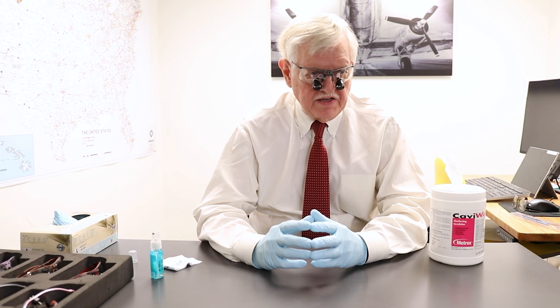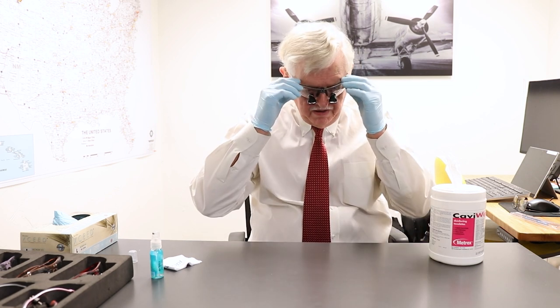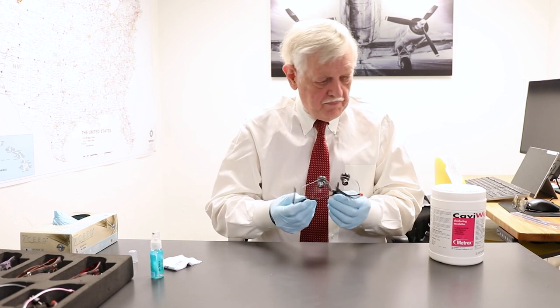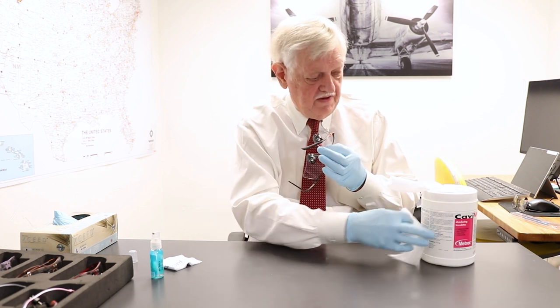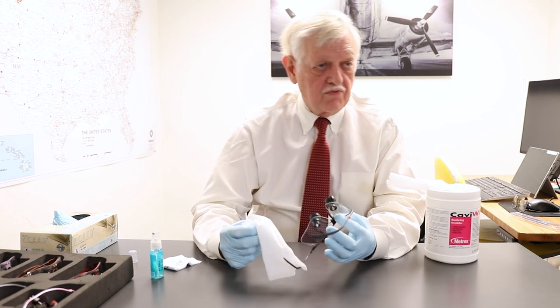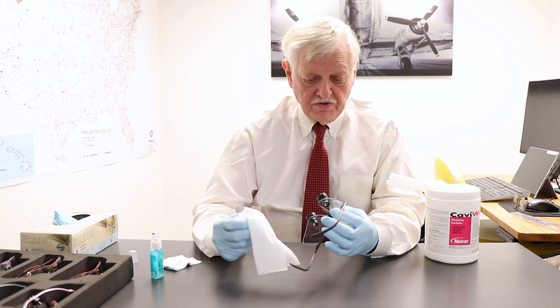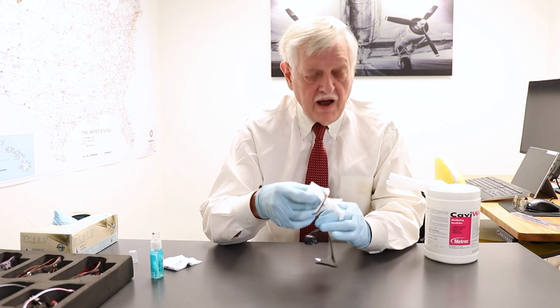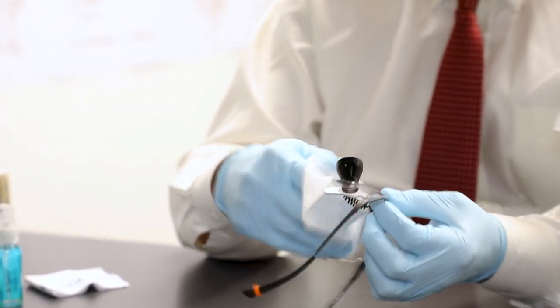When you are finished, what you want to do is terminally disinfect your loops, and the way you do that — typically you may wash your gloves or still have your gloves on — take off your loops and use some type of antibacterial wipes. In this instance, Cavicide is relatively widely available and used in dental offices, but there are many others that can be used, and you need to wipe the entire loop. That means the earpiece, the lens, the nose piece.